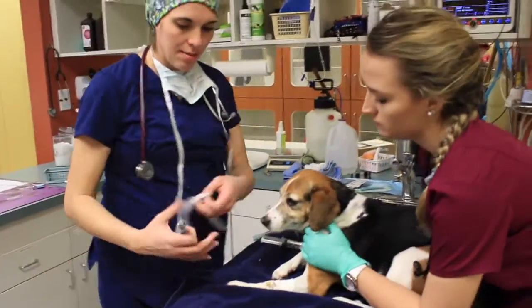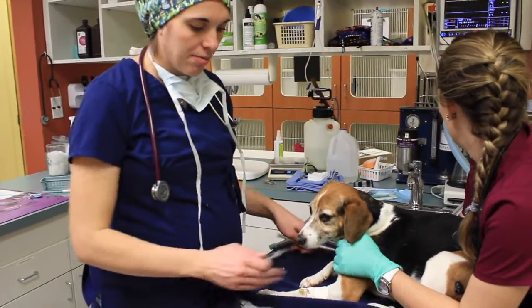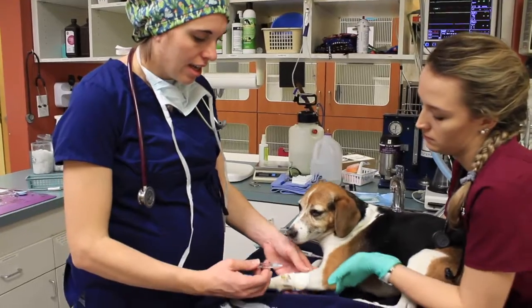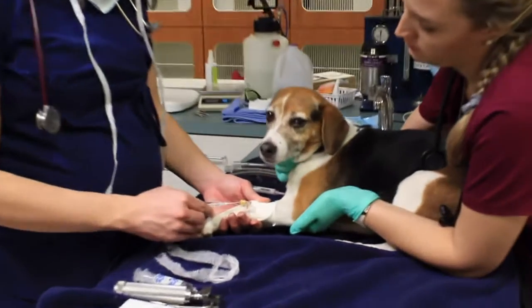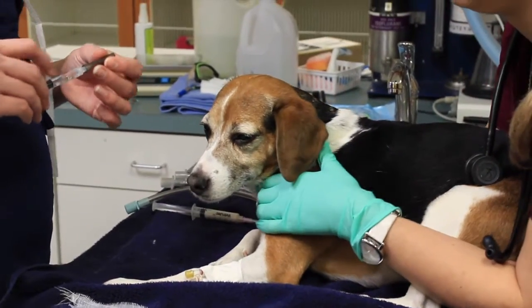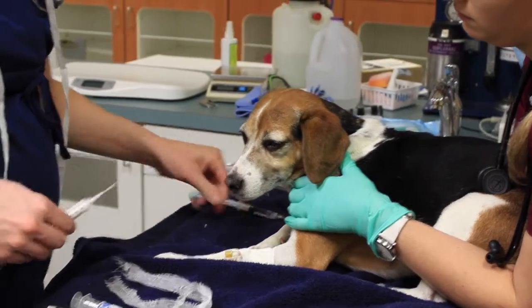The next step of the process is the intubation. We're going to check our catheter to make sure it's still working, and then we're going to give her a medication IV called Propofol. This will make her sleepy enough that we can pass a tube into the trachea to protect the airway during the dental cleaning.